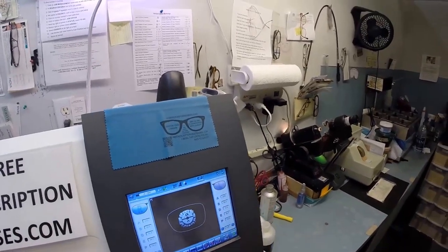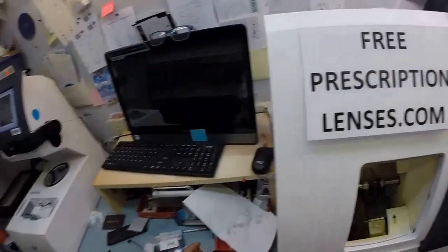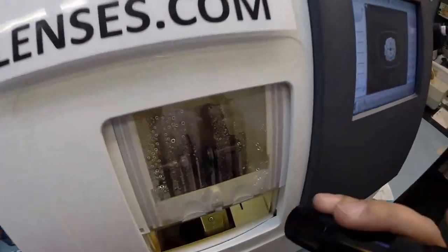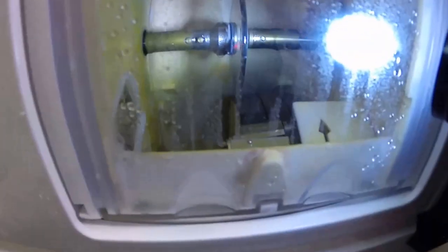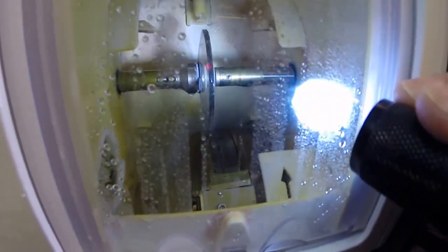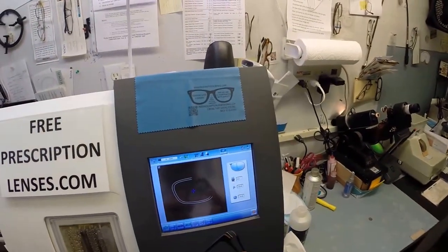Let's go ahead and start cutting your left lens. Let's flip that over to L and hit the start button over here. Actually, where is it? Hit the start button. And again, the door closes. The clamp shuts. The lens is going to be traced by two wide styluses to make sure it's large enough to fit into the frame.